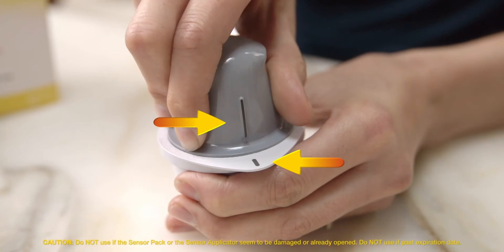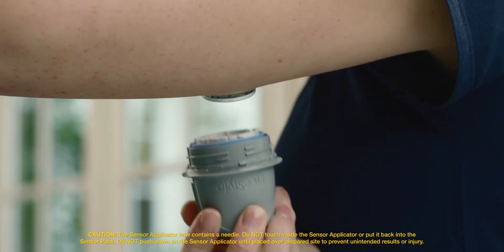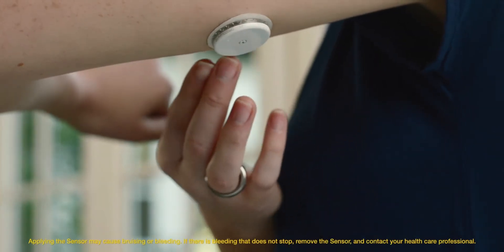Lift the sensor applicator out of the sensor pack. Simply place the sensor applicator over the site you cleaned with the alcohol wipe. Push down firmly until the sensor is in place. Make sure the sensor is secure after application.